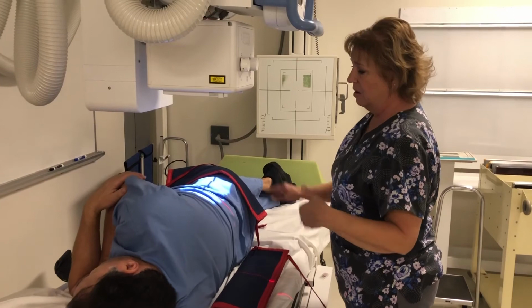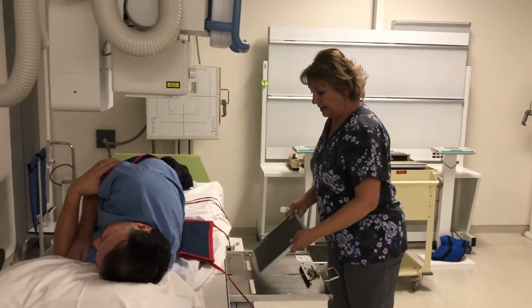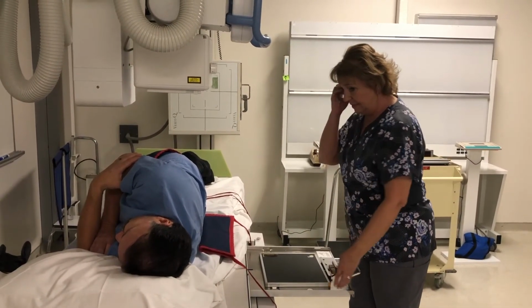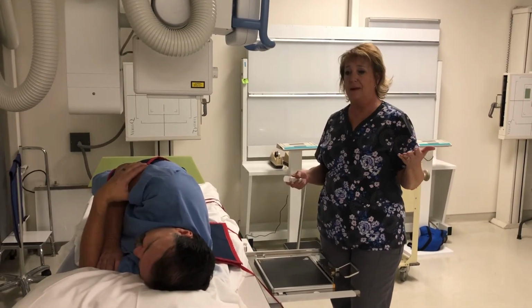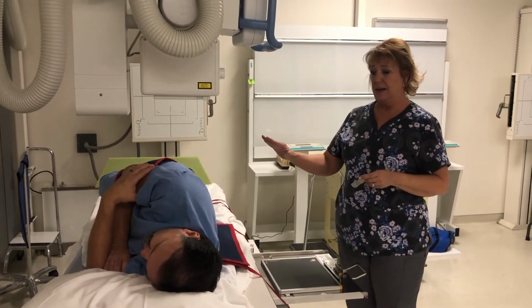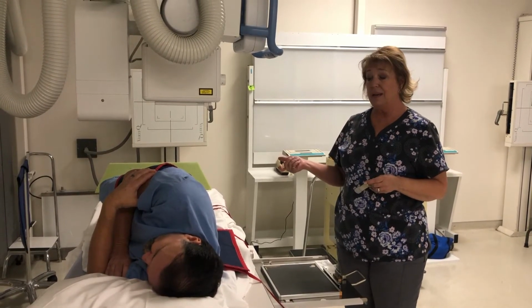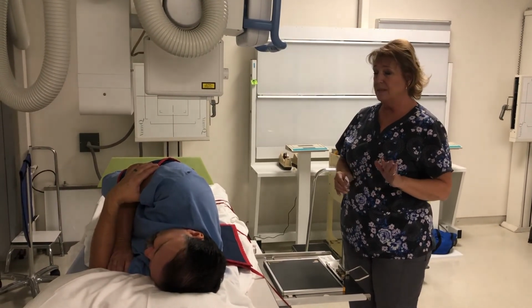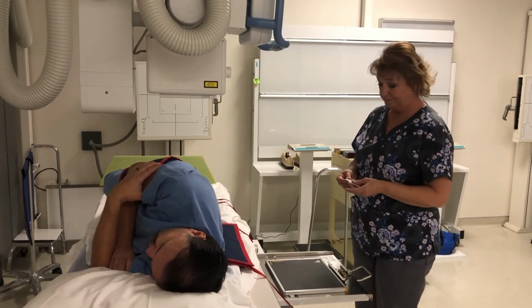Okay, so we're set to go. I have him hold his breath and expose. Okay, now for our L5 S1 spot. Now, I said sometimes you do 2, 3, or 5 projections for the L spine. Sometimes on your lateral L spine, the L5 S1 junction is already open. And so you wouldn't need a spot film unless it was underpenetrated or not open. But most of the time, you still do need to do an L5 S1 spot.